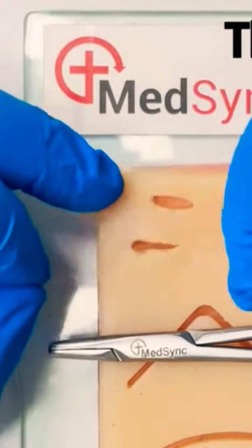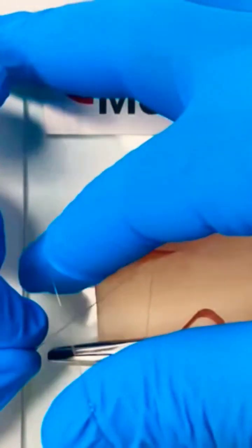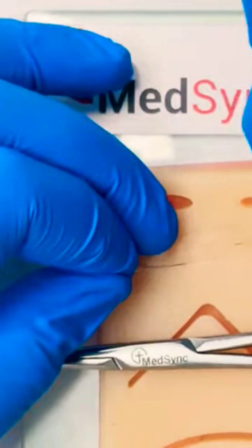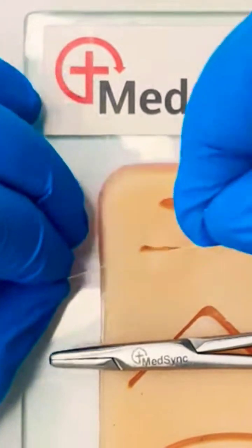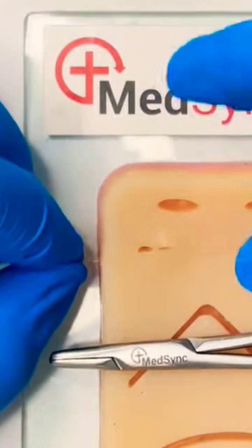As you place the last suture, you maintain the loop of thread in your right hand and the continuation of suture in your left. Keeping the needle on the left-hand side, the right hand retrieves a bight of the thread through the loop. As you pull the suture, the knot will advance into the wound.